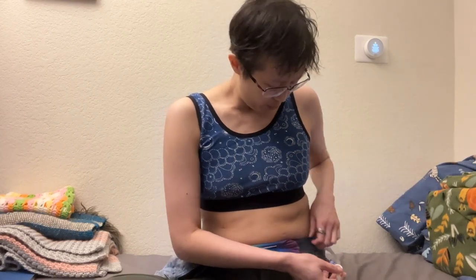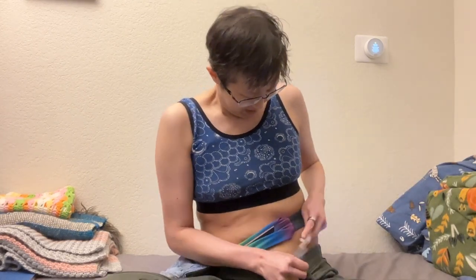The other end is my left one, and it's not attached to a bag — it's capped because we've done some stenting internally to try and open up the ureter again. It seems to be working, and this is basically a trial to see if they can take out that tube entirely. In the meantime it's kind of dangling around, so I just tuck it in my underwear, and that generally keeps it out of the way and not waving around in the wind.